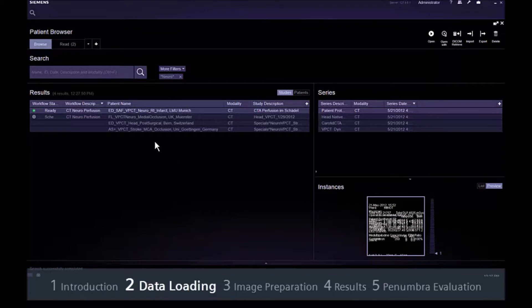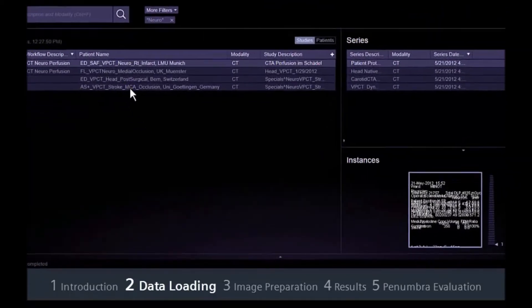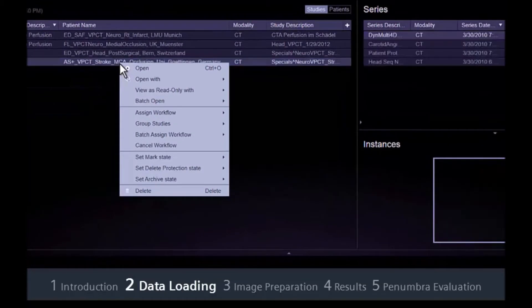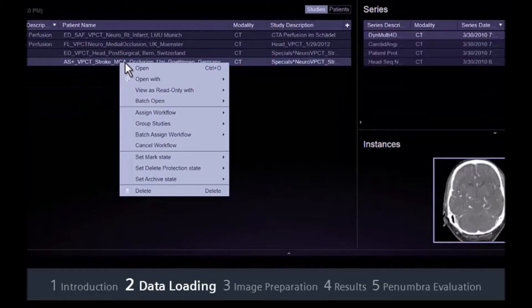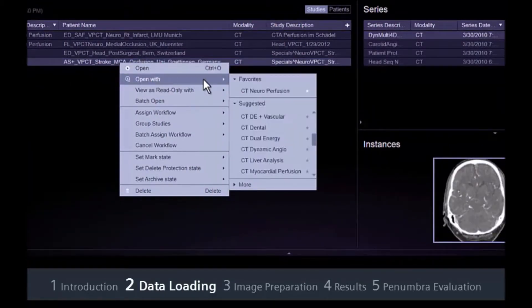First, make sure that the study is correctly assigned to the CT Neuroperfusion workflow. Otherwise, click with the right mouse button and select Open with CT Neuroperfusion.